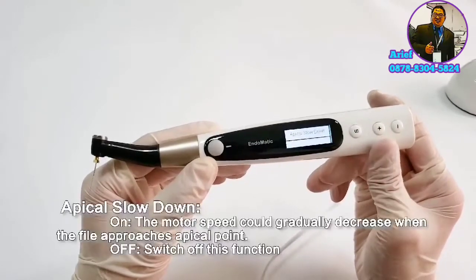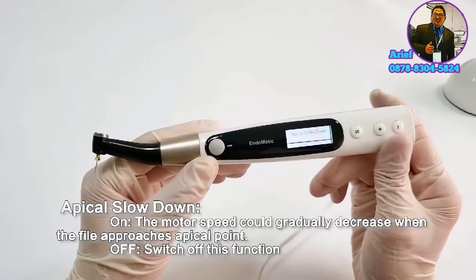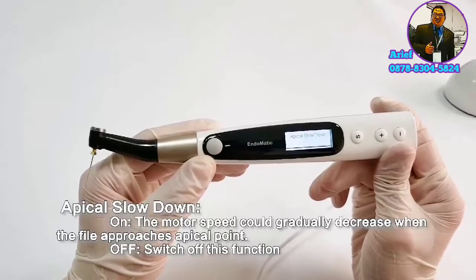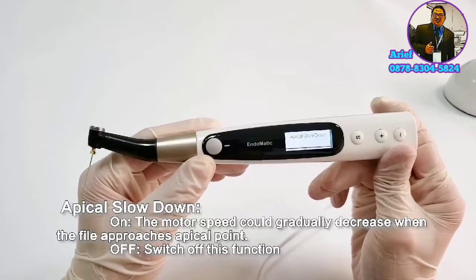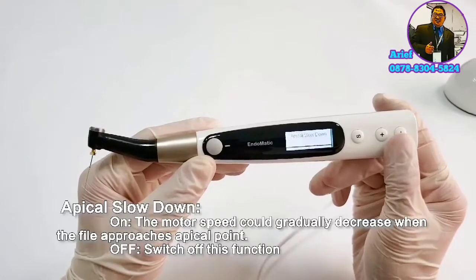The last small function is apical slowdown — there are on and off modes. If you switch to on mode, the motor speed gradually decreases when approaching the apical point. If you switch to off mode, this function will be disabled.